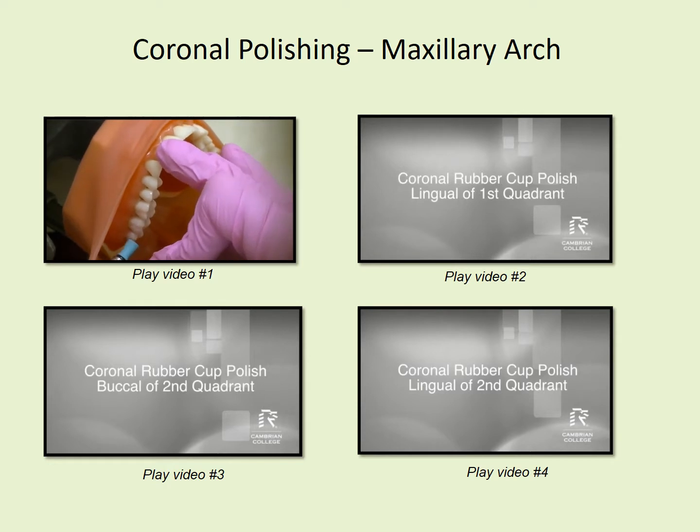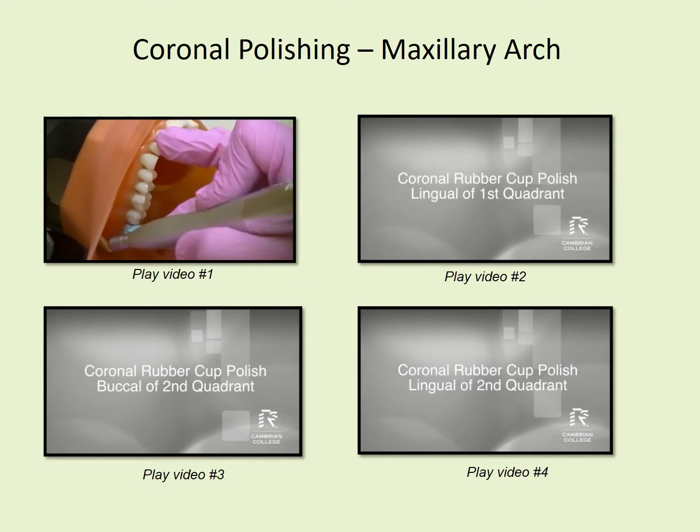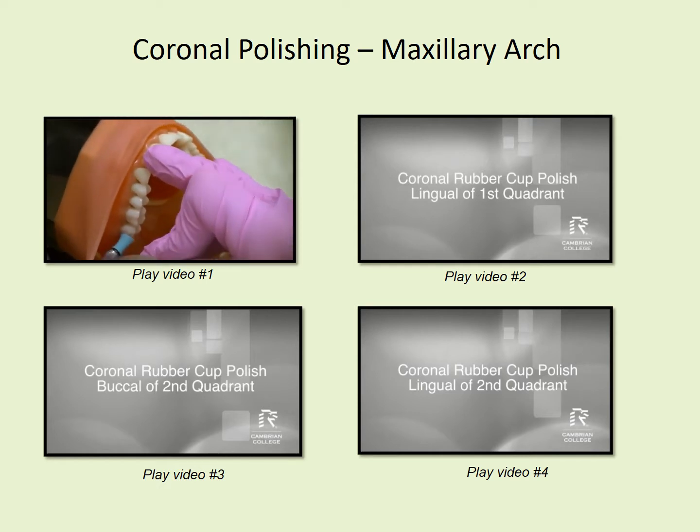And then again, if there's stain on the incisal half, do another sweep with the polisher.